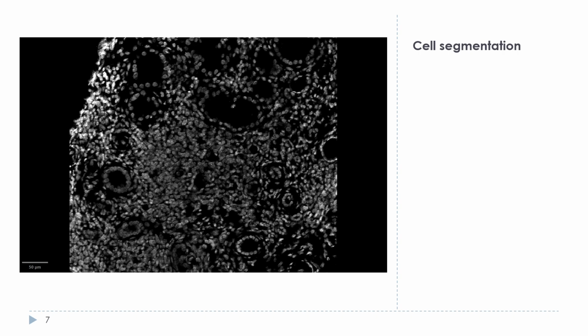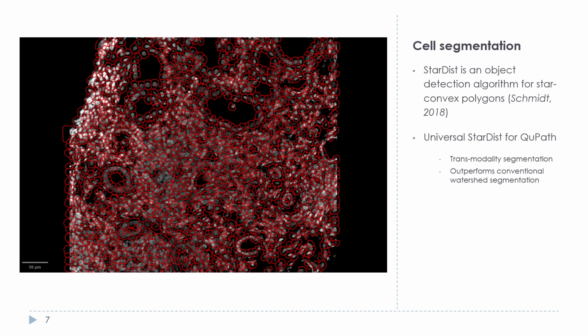As with most immunohistochemistry analysis workflows, we must first segment cells. We perform cell segmentation using the iridium-193 intercalating agent as our nuclear counterstain, which is functionally similar to DAPI used in immunofluorescence microscopy. StarDist is a machine learning algorithm used extensively in segmenting DAPI stained nuclei. One attribution for its widespread implementation in many digital pathology workflows is the large training dataset used. But since no pre-trained models exist for IMC images, I've been able to transform the iridium channel into a pseudo-DAPI image, enough to enable robust segmentation of our kidney samples.